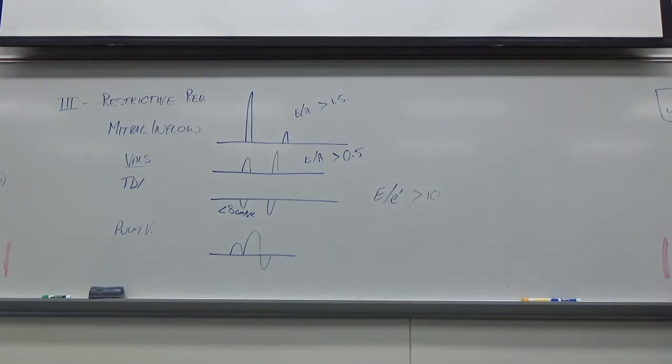So if I'm following this patient up, once it hits below 35, that's fine for diagnosis, but if I'm following up this patient, I scanned him a year ago, now I'm scanning him again today, I expect to see wider A duration and a higher velocity on that AR. Okay.